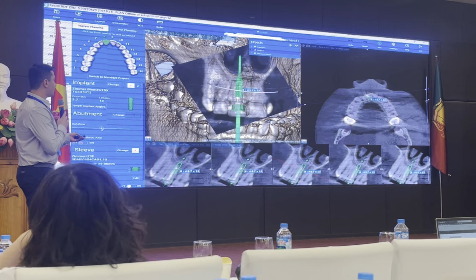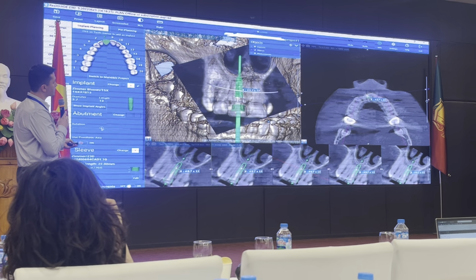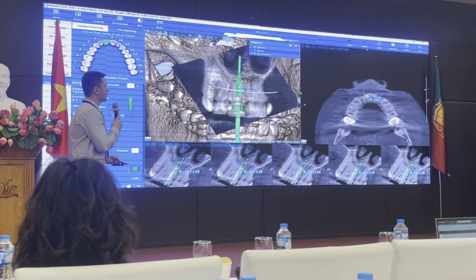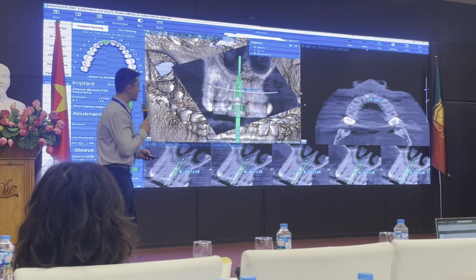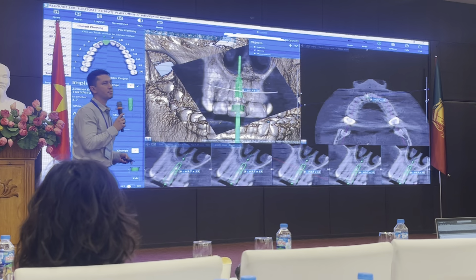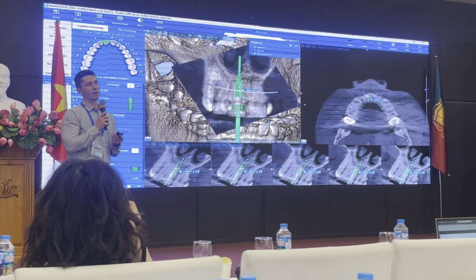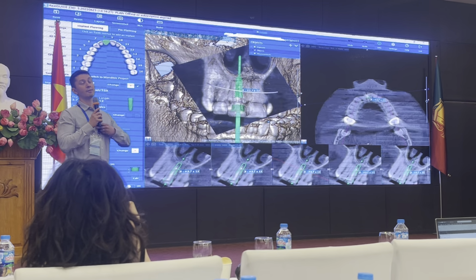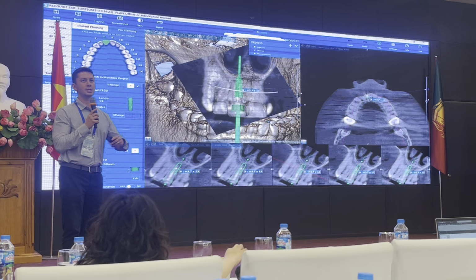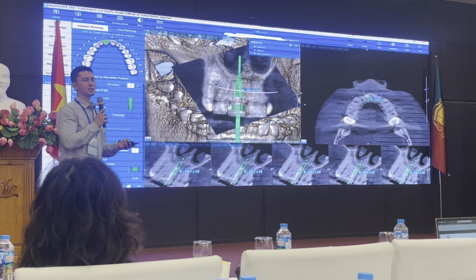Thanks to this technology, we can evaluate possible implant size. We selected a 3.7 by 13 millimeter implant, and we know, based on research performed with Dr. Dennis Tarnow, that there's a good rule of thumb to evaluate how deep to place an implant. In the anterior aesthetic zone, I've done many cases where I didn't understand the proper depth of how deep to place the implant. How deep is deep enough, and how deep is not deep enough?